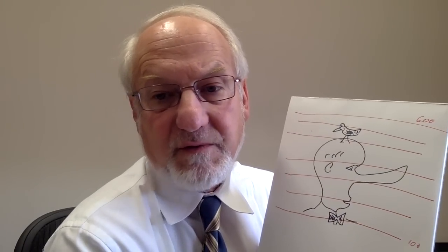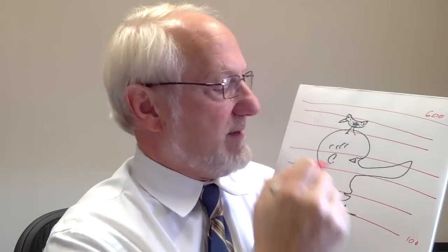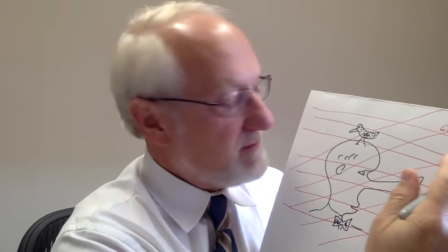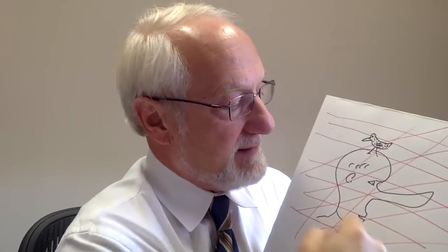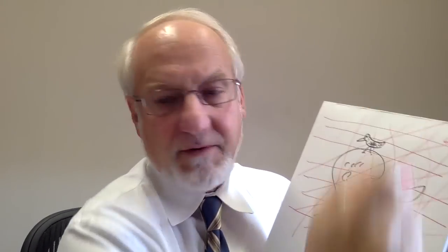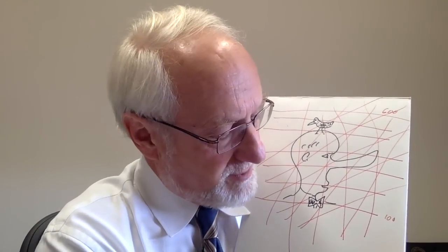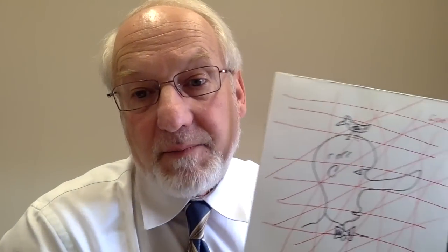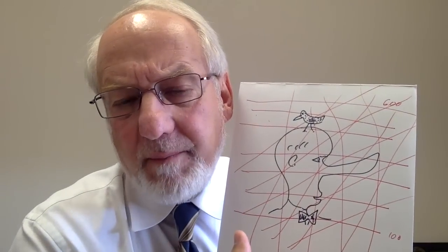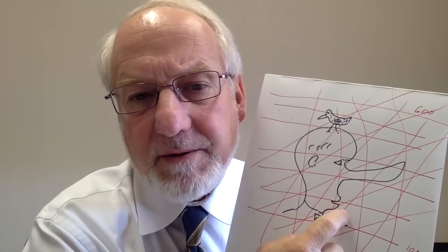Now those numbers aren't useful for anything, but it turns out that if you rotate the array and you do it over again, and collect those numbers, then rotate the array again and do it again, collect those numbers, and finally let's go all the way around to vertical and collect those numbers. What you get is a mess. And those numbers can be added up by a modern computer. And the magic is that if you take all those numbers and you add them up and you do the right computations, you get back the picture.